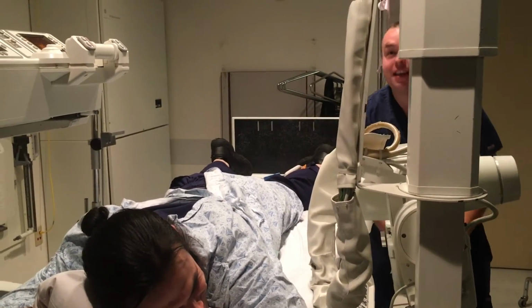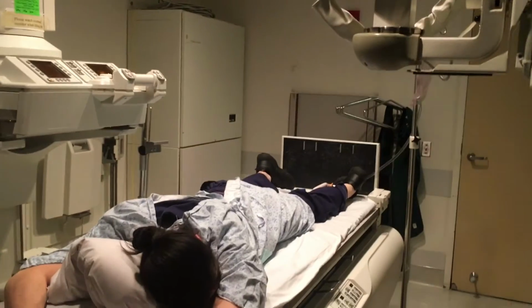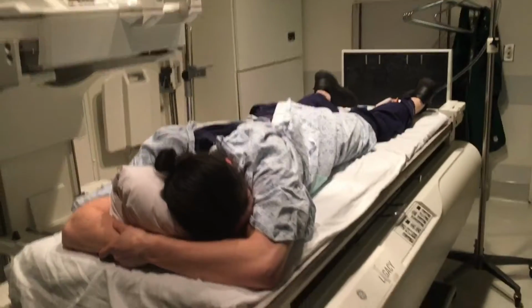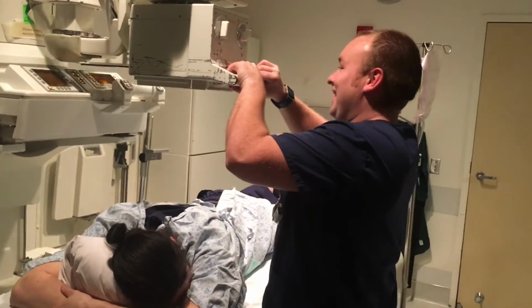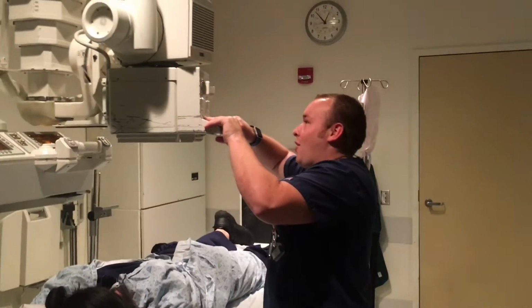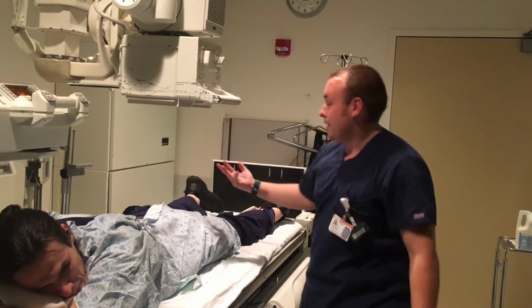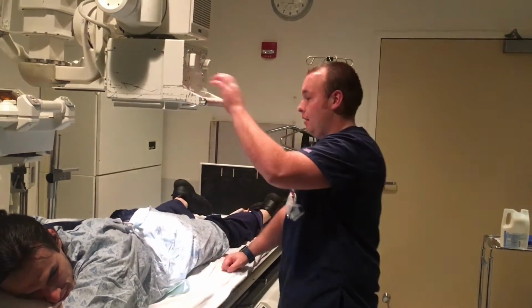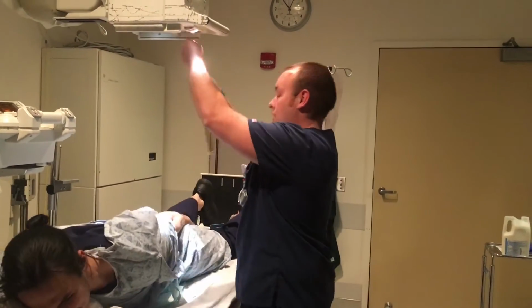And get this baby back in order. This is the right way. I don't know why it makes that noise. This is the correct way. Alright. We're doing a PA post evac. Basically a PA KUB. Mid-sagittal, iliac crest. I'm going to go 48 inches, make sure I get the whole abdominal area.